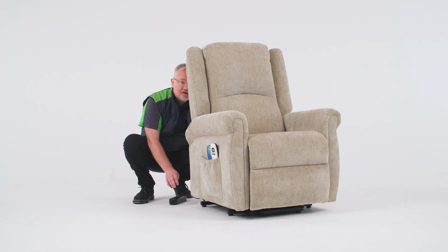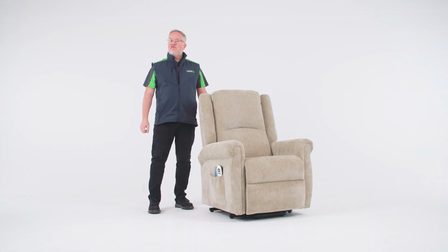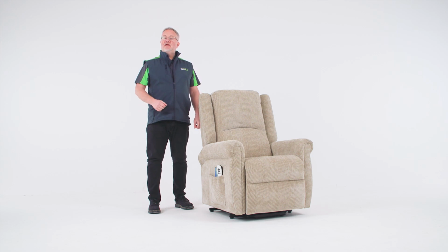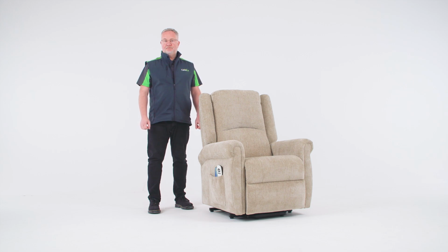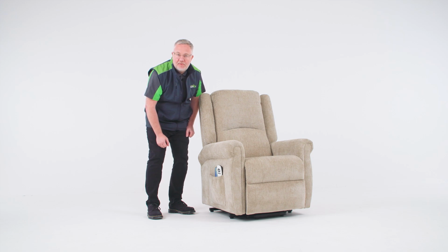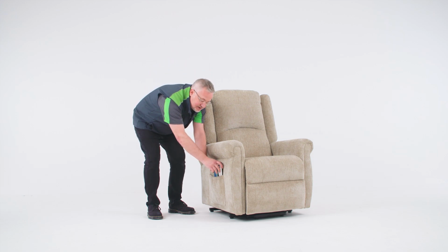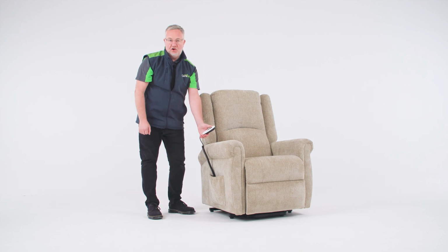We can now take the 3-pin plug and place that into the power outlet. With the chair now fully assembled and plugged into the wall socket, we're going to check the heat and massage and the rise and recline function of the chair. In order to do this, there are 2 handsets which will be located within the right hand side pocket. For now, we're just going to check the white handset, which is the mechanical handset for raising and lowering the chair.